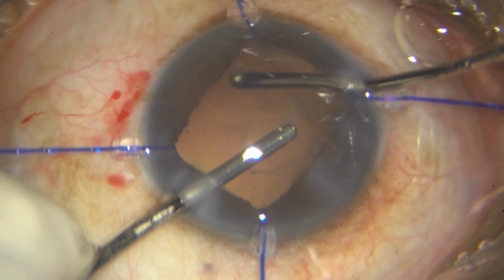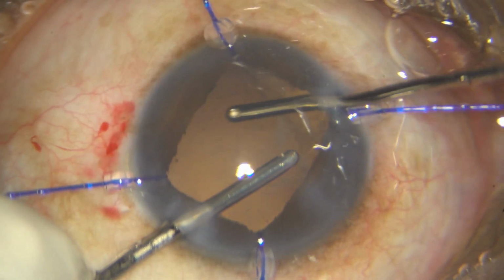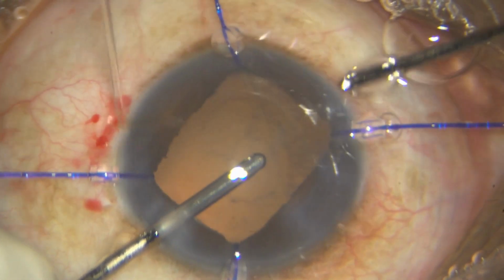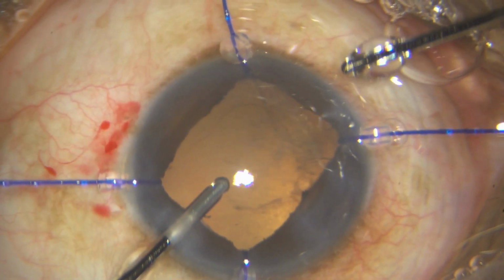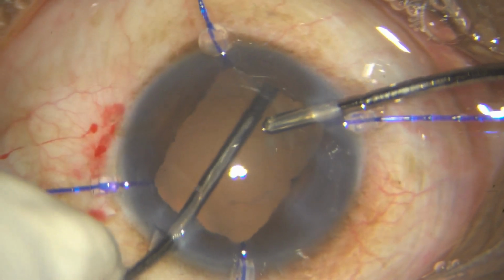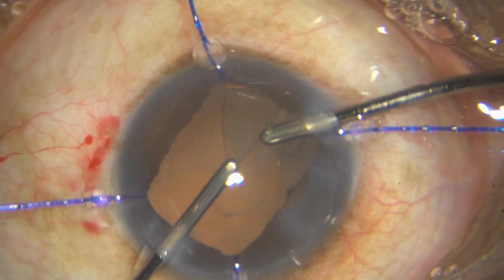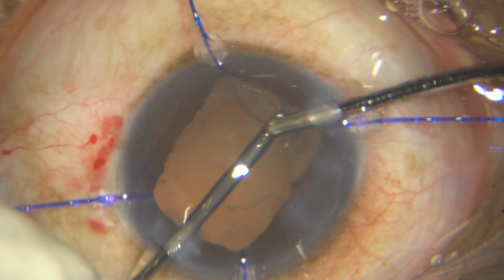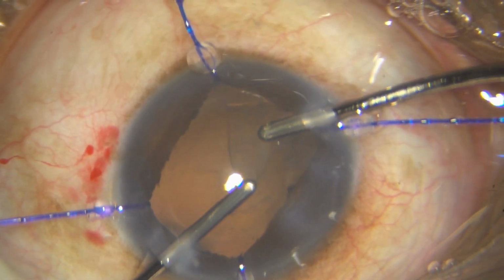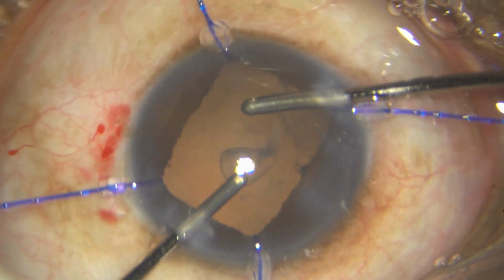And you have to have a lot of patience for this. So I just switch hands to get to the other side and see how much cortex is coming out. You cannot leave cortex in these cases. You don't want any post-op inflammation in these cases. See, it's not aspirating because I haven't picked up the parameters. Once I increase, it will aspirate.